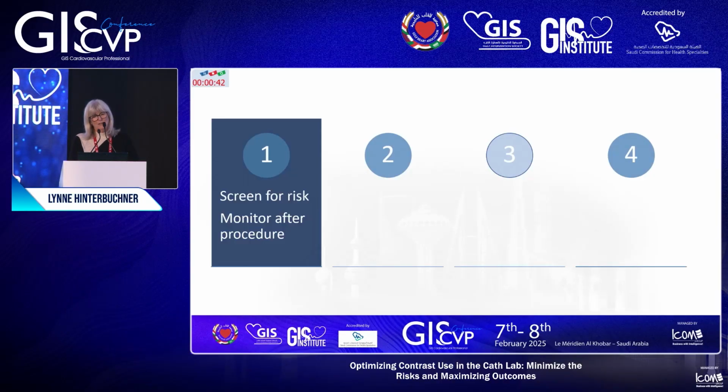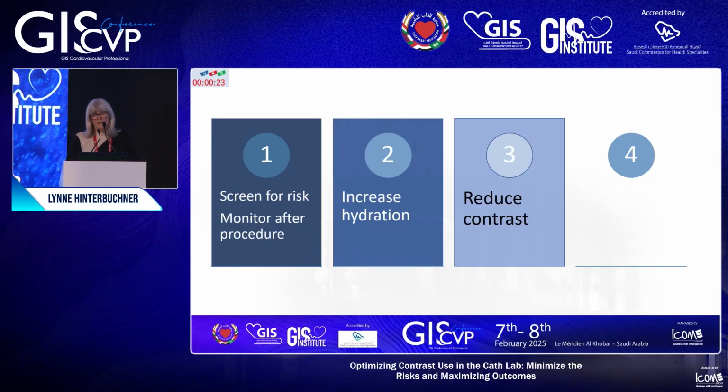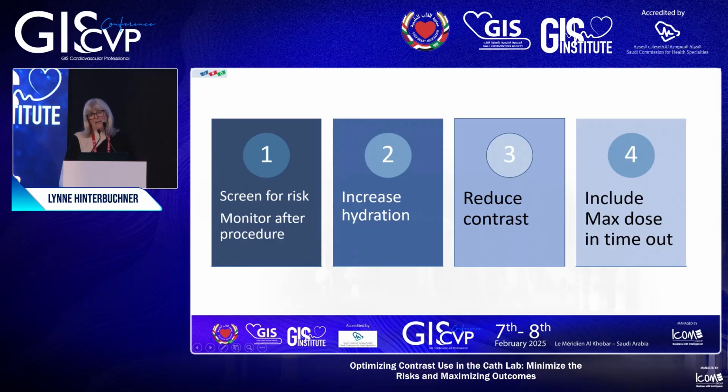So hopefully you've gained the knowledge today to make sure you're screening for risk before the procedure starts and monitoring after the procedure. If you have a patient that is moderate to high risk of having injury, make sure you're still monitoring them after the case, 3 to 4 days out. Increase hydration, give them those fluids, better to give them than not. Reduce the contrast use. And last but not least, include your maximum dose in the timeout before you start your case. Make sure everybody in the room knows when to stop.